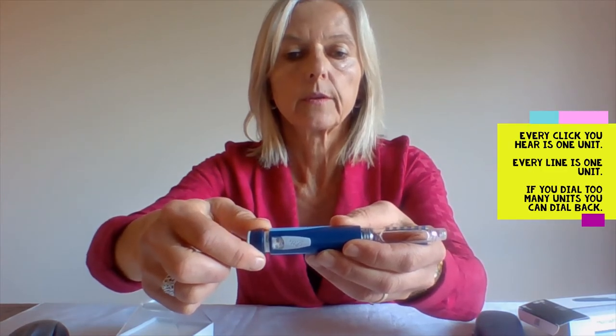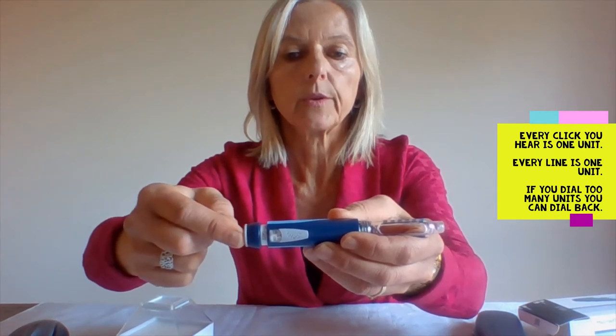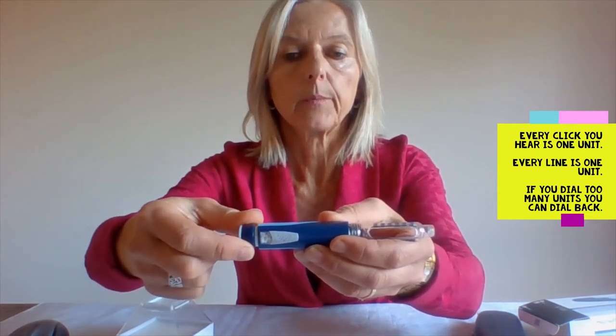Every number is one unit of insulin. You can dial up by one unit and every click is one unit. Every line indicates one unit. If you dialed too many you can dial back.